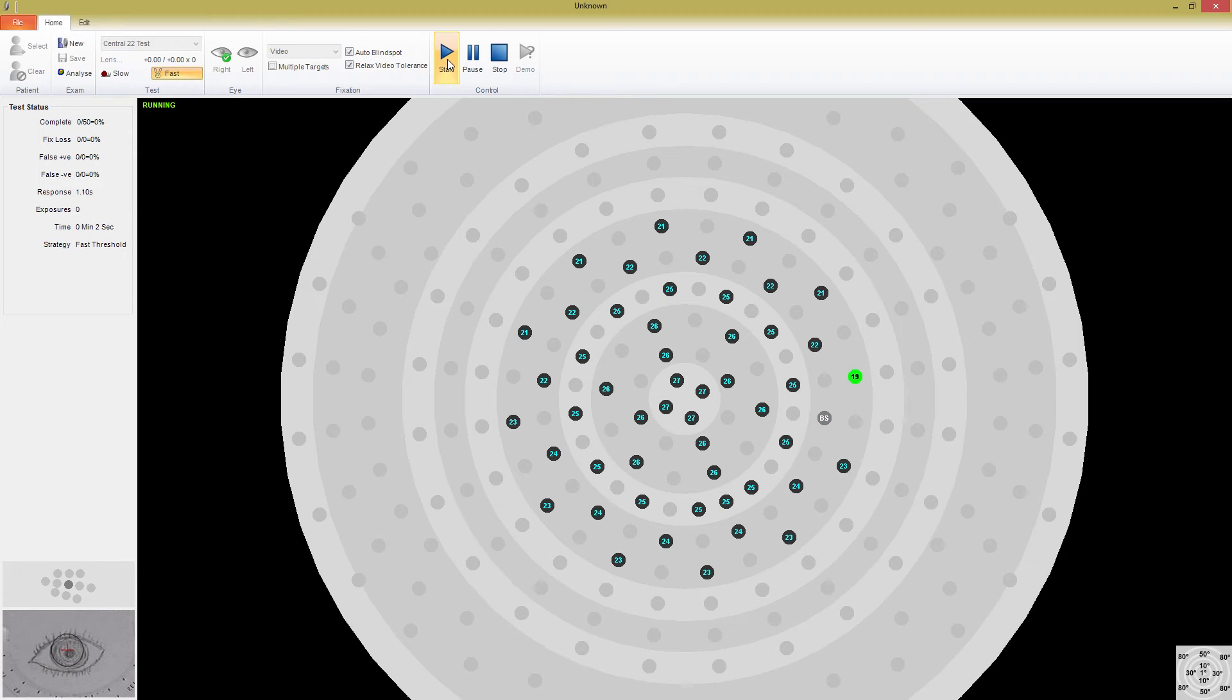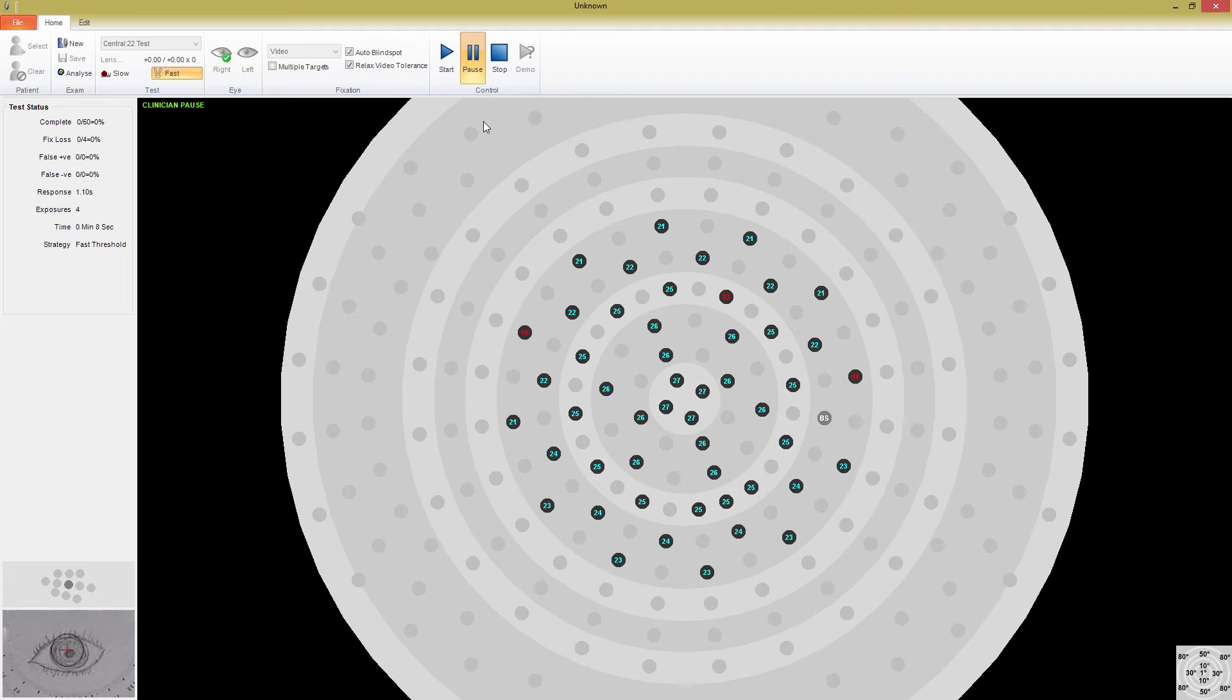You can pause the test at any time by pressing the Pause button, and then start it again using the Start button. The patient can also pause the test by holding down the patient switch.